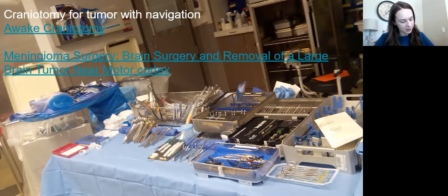So let's look at 1,144. Let's look at your burr hole. So you can see the pictures of the different burr holes where they were made and how it encompassed all the way around in a circle, but this can always be different. So I just wanted to point that out. So you can see on this setup, this is like for a keyhole surgery.